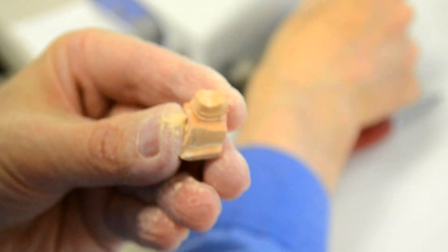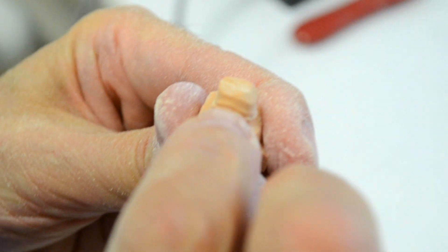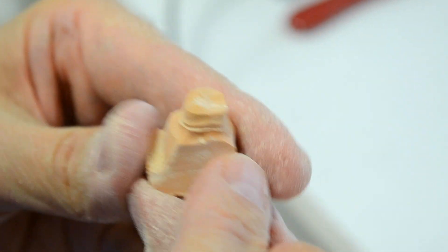I've just about completed that aspect of die trimming, and as you can see now, we're left with a small lip of gypsum product that represents part of the free gingival margin.